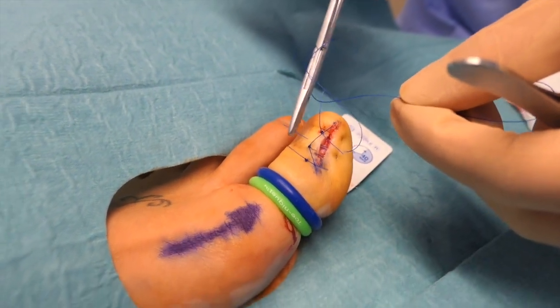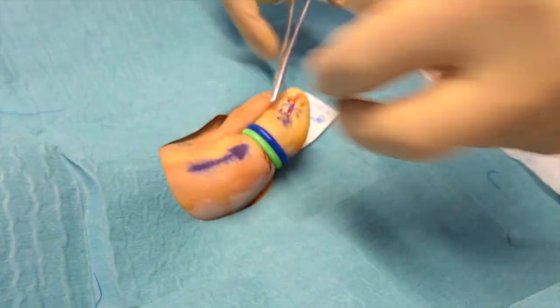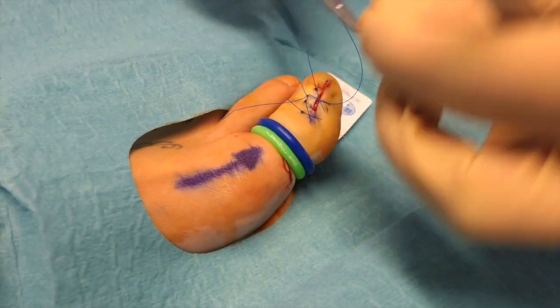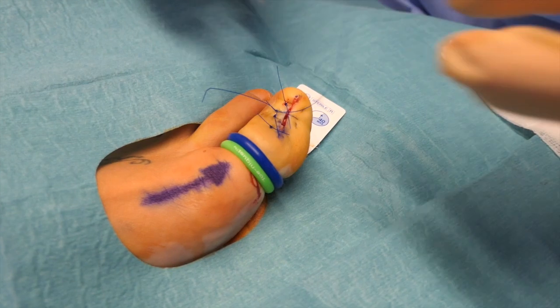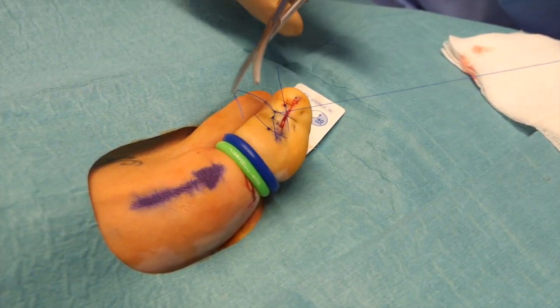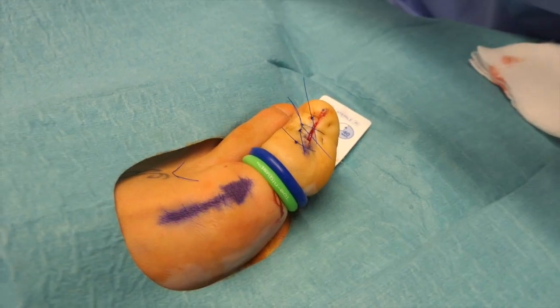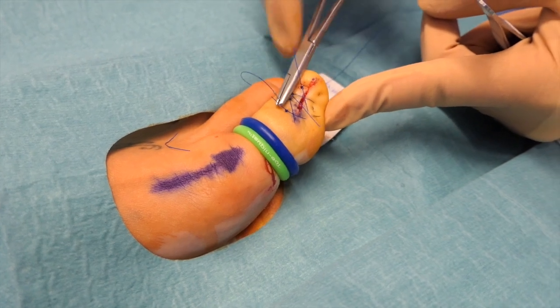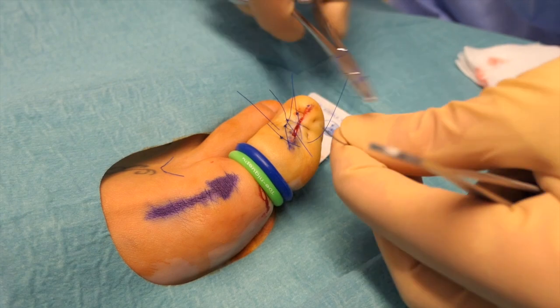Just going to get my hands in your way, Rory, excuse me. And that's pulling down nicely. One more and then we'll be done. Stitches will come out in 2 weeks' time. A little bit more sore than a phenol technique. We maybe use a little bit more analgesia than we would for a phenol. We're just at the end of the stitch now. 1, 2.